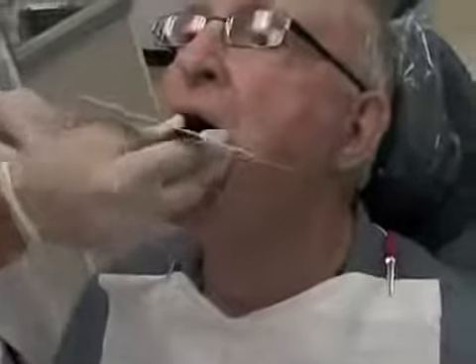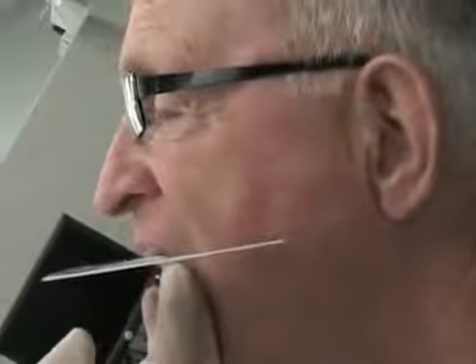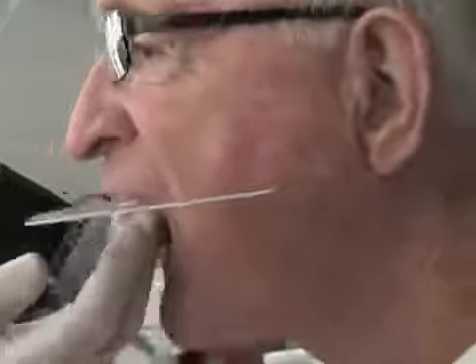A Fox plane is an instrument that can be placed against the occlusal plane to ensure that it is parallel both to the ala-tragus line, from the ala of the nose to the tragus of the ear, and also parallel to the interpupillary line. You may find that taking a patient's glasses off makes it easier to check to make sure that that plane is parallel to the interpupillary line.